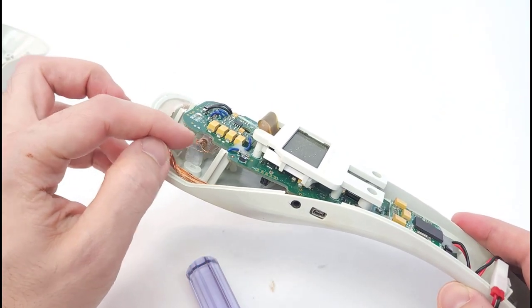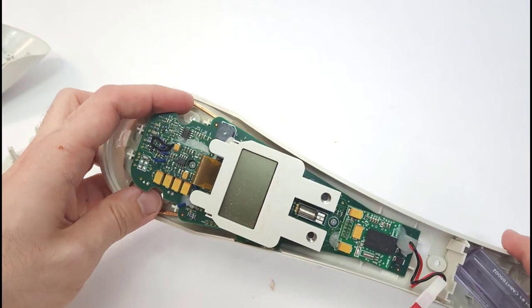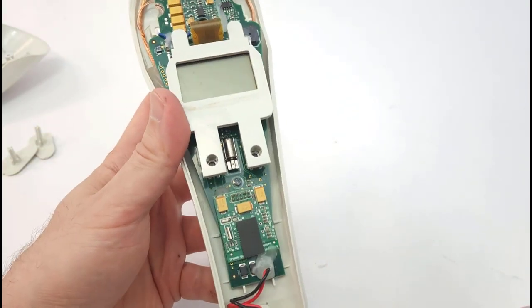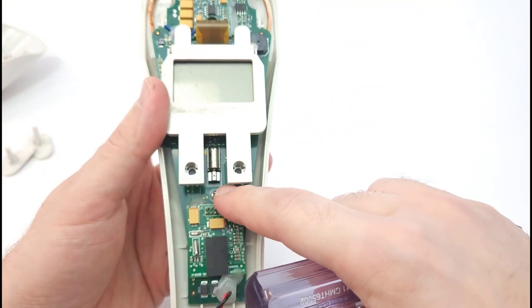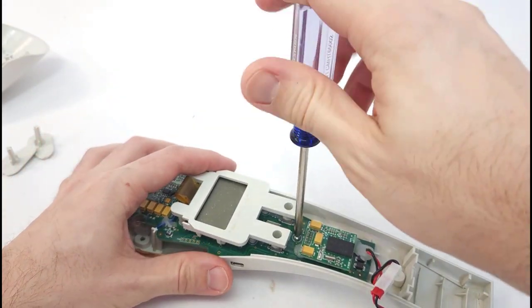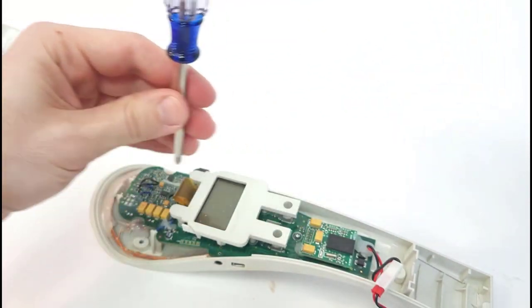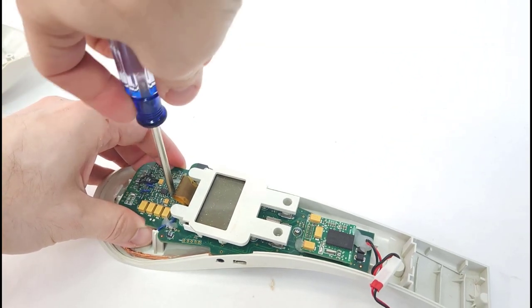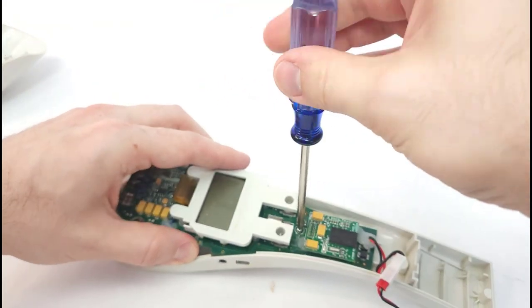So I have already repaired this one, but I'm going to complete the disassembly to show you how to access it, because you can't necessarily really get to it easily under the circuit board here. So you're going to look at the top of the circuit board, and there will probably be, in this case, two more screws, one there and one there, that I'm going to remove to take the circuit board off and give me full access down into the bottom of the case to fix that electromagnet. So two screws there, gonna loosen them. They're just going into the plastic of the case, so sometimes they can sort of start to strip the threads.